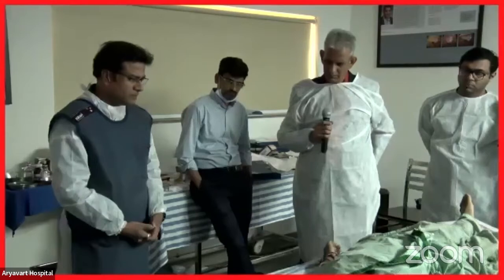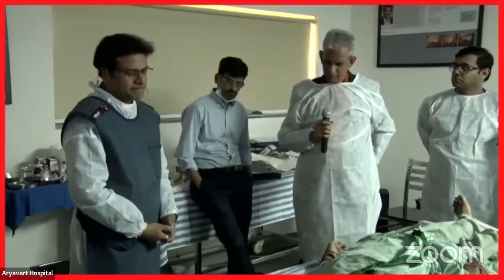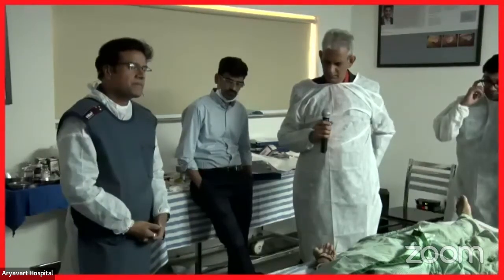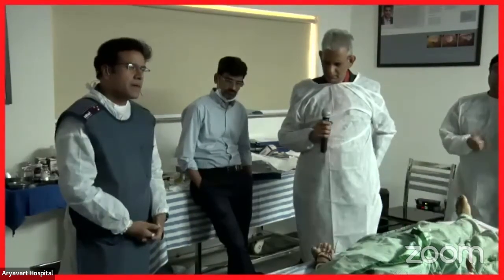One is the transverse colon and the second is the small bowel. Identification of the small bowel is the key, so we must work our minds more.